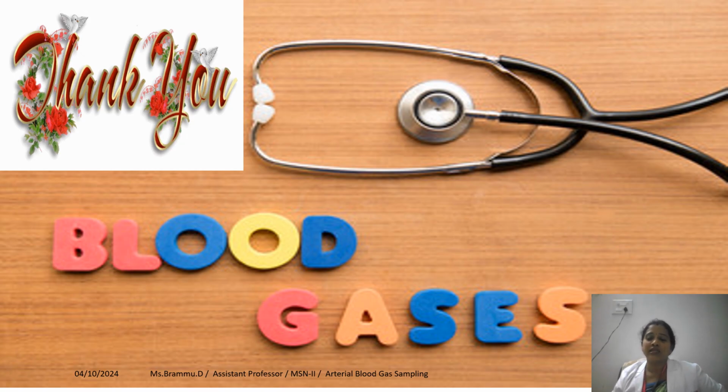How do we do it in artery puncture, what tests we need, what requirements we need, and what things you have to note before you take the sample, such as I told you the ventilation, FiO2, and the patient temperature, which plays a major role, or it can have certain biases, such as how much sample you take, how vigorously you mix the sample, and what the procedure is, sterile technique, and how you do the Allen test and so on.